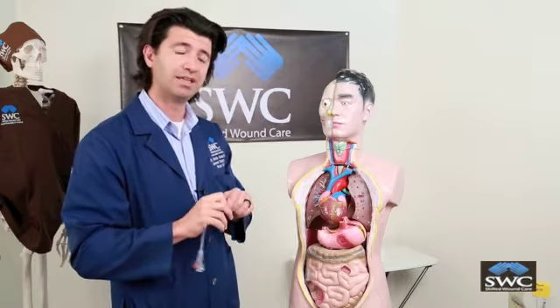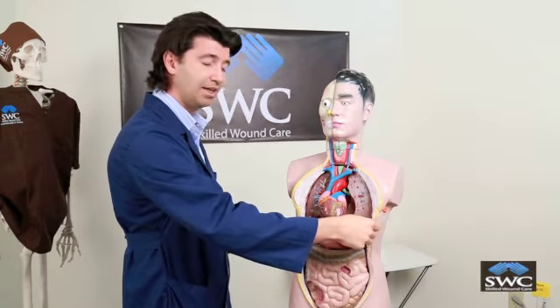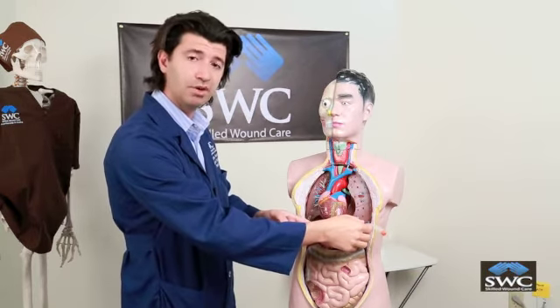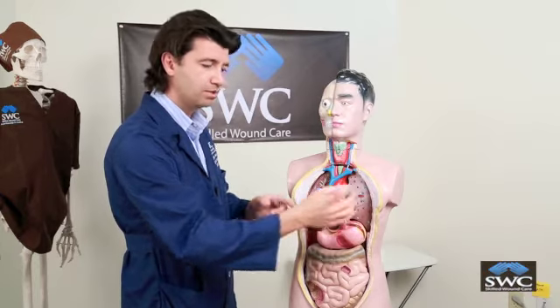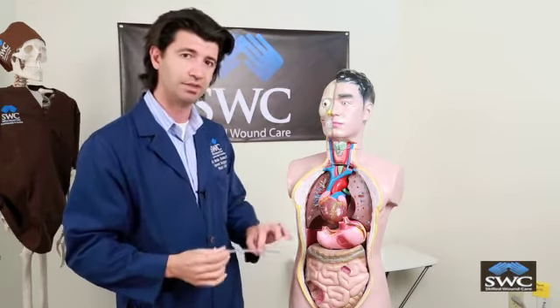The worst problem that it could cause is a gastric outlet obstruction if the tube goes all the way into the patient's stomach and goes to the pylorus, which is the emptying part of the stomach, which is something we don't want. So that's why it's important not to use Foley catheters as a gastrostomy tube. Secondly, as it goes back and forth, it also stimulates hypergranulation tissue. So it's very important to make sure that the tube is snugly fit there so that you don't get that hypergranulation tissue. Hypergranulation tissue can be treated with silver nitrate over 3 treatments, and the hypergranulation tissue usually disappears, and these tubes can be changed to a larger tube so they're not slipping back and forth through the stomach.